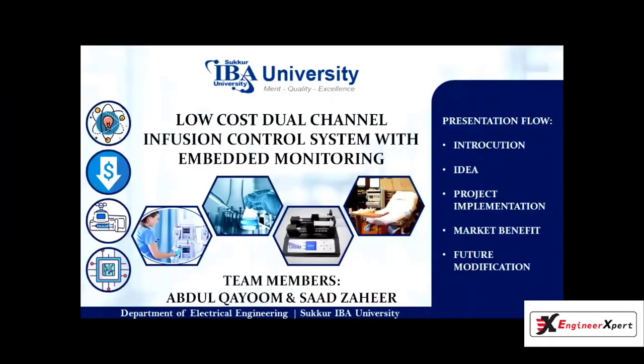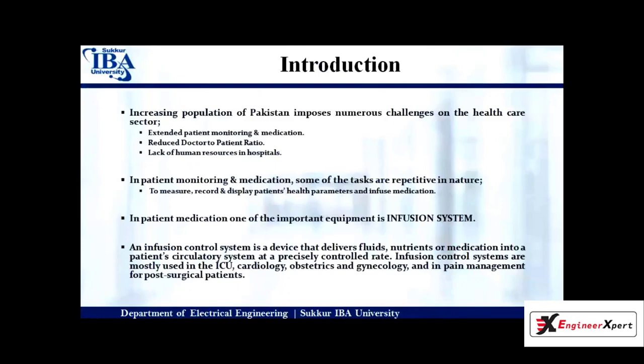The title of my presentation is low cost dual channel infusion control system with embedded monitoring. So the flow of my presentation is following. I will give you a little brief introduction, then the idea, project implementation, market benefit, and the future modification. Please next. So let's start with the introduction.